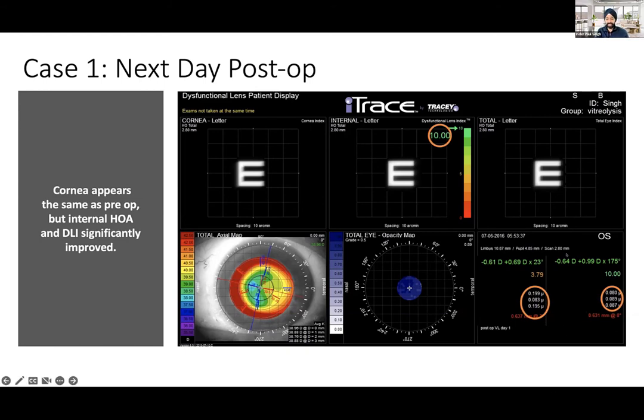The refraction did not change significantly between day one, and so it's not a refractive error change, and it wasn't a bad scan. This is just truly, we got rid of the floater. Now, if you look here, that's pre and post. Now look here, even more details.